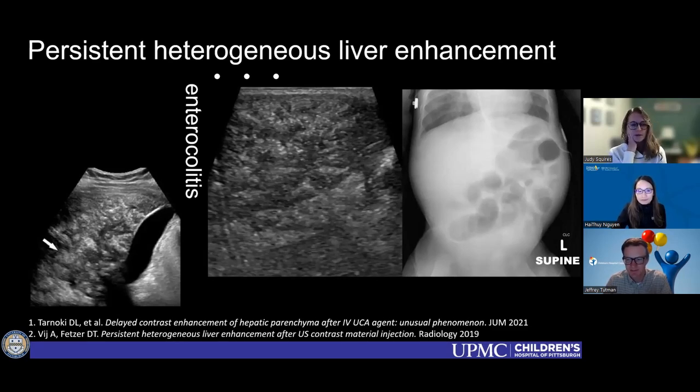No, I could talk all day long about brain contrast enhanced ultrasound, but the safety profile is identical to other indications. You're just putting your transducer somewhere else. The one thing I will mention with concern for brain contrast enhanced ultrasound is that as these bubbles are expanding and contracting, if you purposefully rupture them, there is some theoretical risk to local structures. It's called sonoporation. So I don't ever increase my mechanical index once I have contrast on board. I don't do any sort of flash, like high mechanical index imaging to purposely destroy the bubbles, because I don't want to cause any damage whatsoever to the tiny super sensitive structures in the brain.